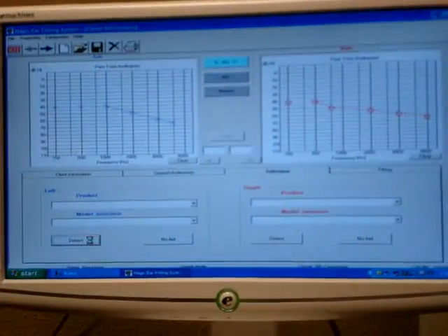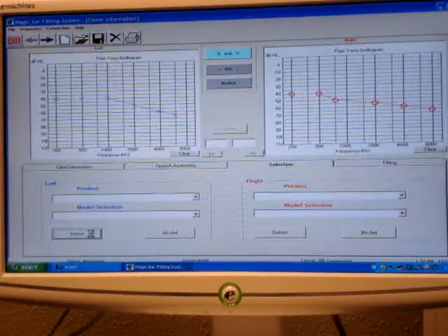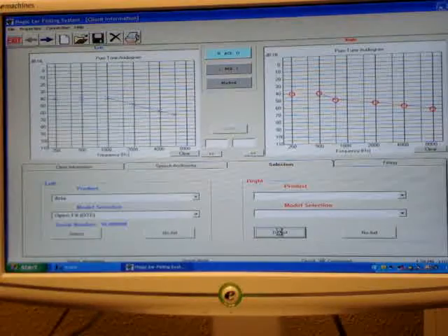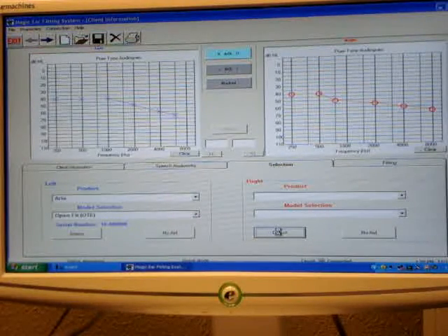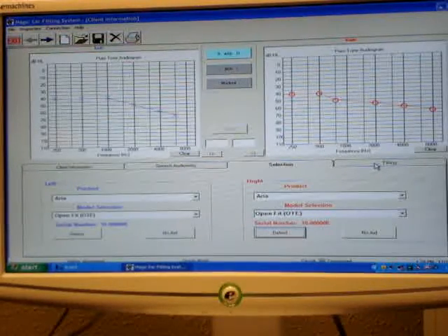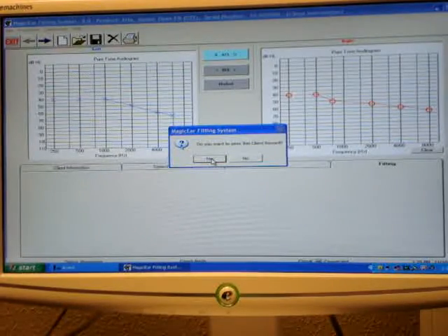Click the Detect tab. The software will automatically detect the model and type. Next, click the Fitting tab. It will ask you if you'd like to save the client's information.